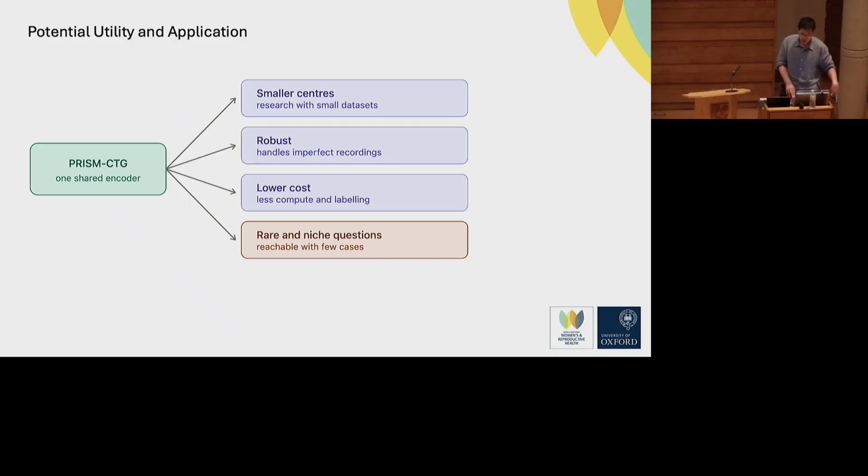As shown in our analysis earlier, our model has learned a working knowledge of CTG and delivered strong performance. It was done simply by pre-training with the right clinical context. This work is especially helpful for researchers with small labeled data sets. They also seem to handle signal dropout well, which is valuable for the intrapartum setting, considering that they tend to have noisier CTG.